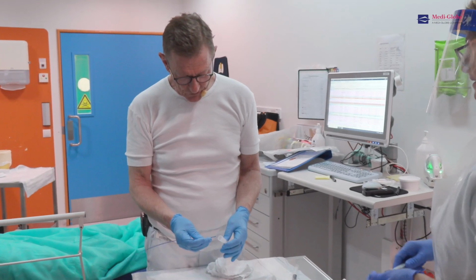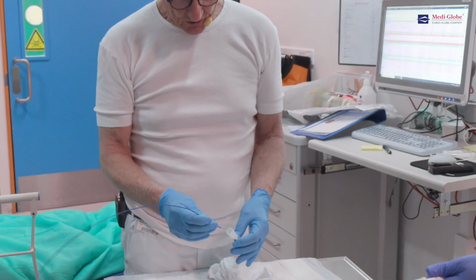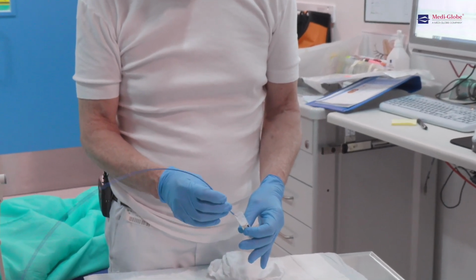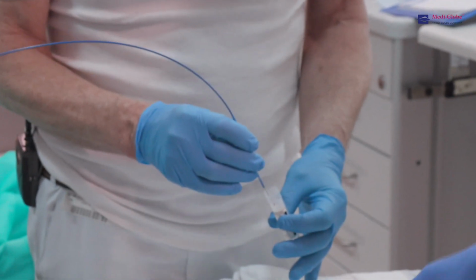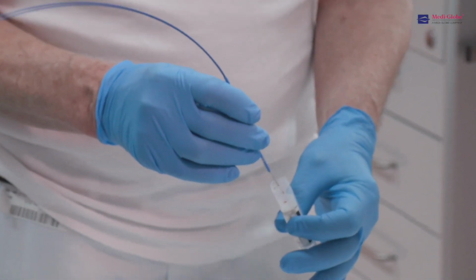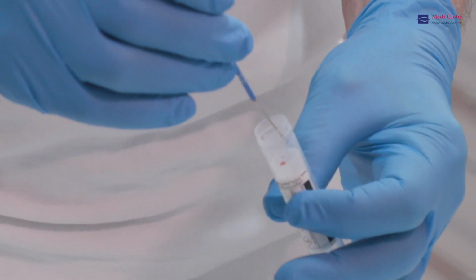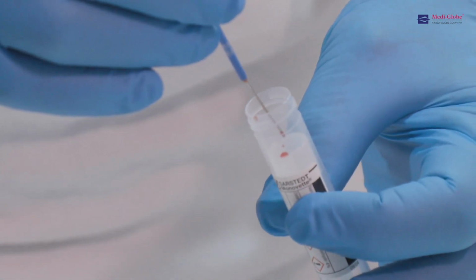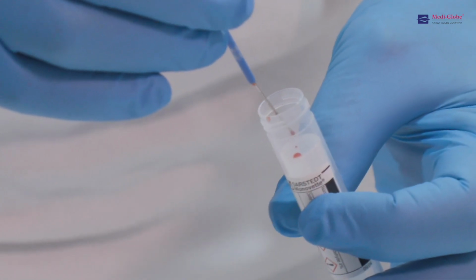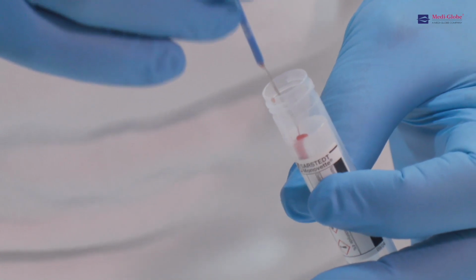The needle tip is going out. This material is, of course, histological material. So we will finally put this in formalin. Whenever it's difficult to expel, the stylet is good, and also this is often a sign of a blocking core. So yes, we get very good material here. Very good material.